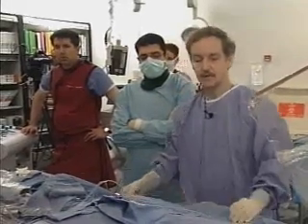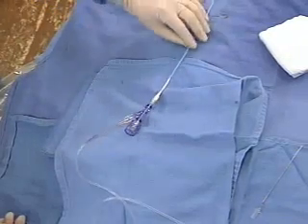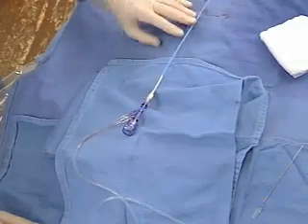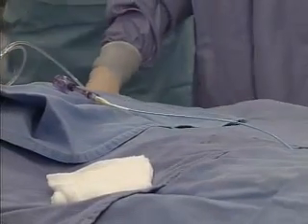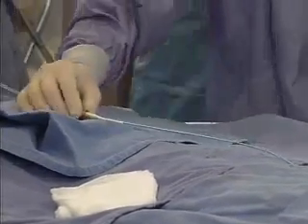At this point, we have introduced a sheath into his femoral artery. We have, through that, already taken some pictures, and we have a catheter which goes to what is called his right coronary artery, supplying the bottom wall of his heart. And we have to take some further pictures to well define the lesion. Lesions are not always concentric, but often very eccentric. And so with that, we're going to take a picture in what we call the LAO projection. I'm going to flush, please, a little dye. Okay, we're going to manipulate the catheter into the vessel.